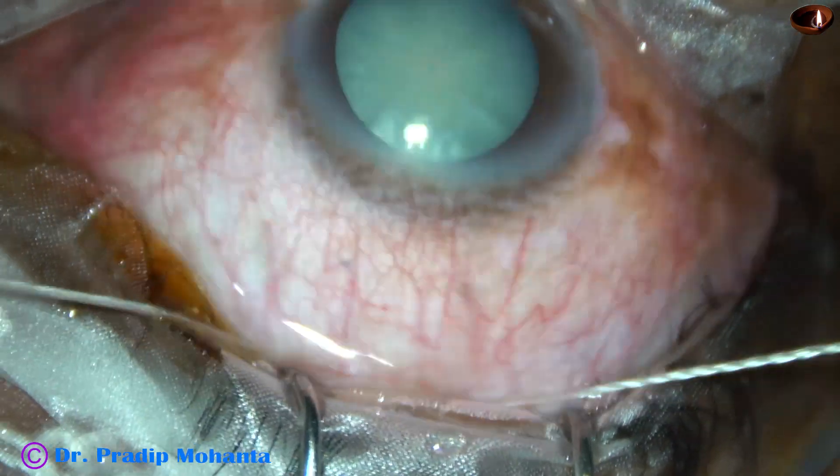There will be minimal amount of surgery-induced astigmatism now. For opposition of conjunctiva to the limbus, I never do cautery to contract the tissue — it is not foolproof, and I don't like destroying and burning cells. So I place a releasable suture at the right side of the peritomy where there is a small radial cut. On the left side of the peritomy there is no radial cut, so it will get nicely opposed as we pull this suture.